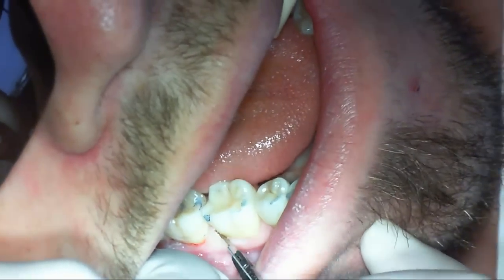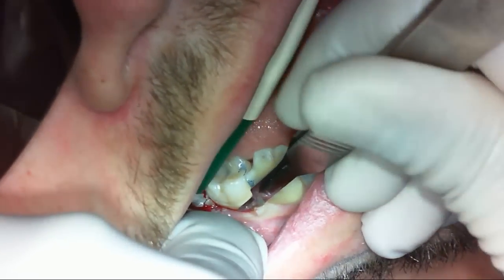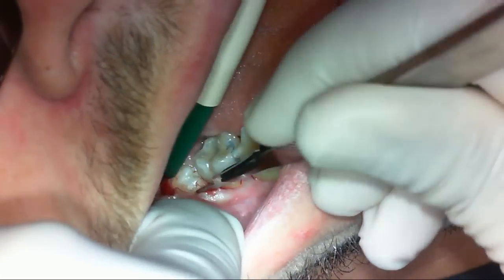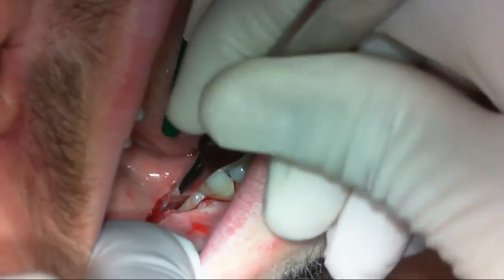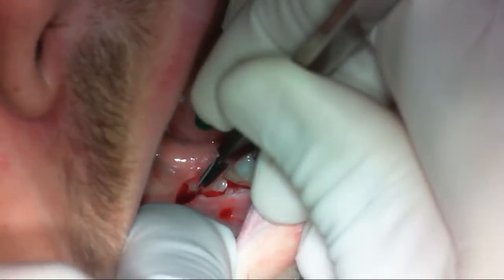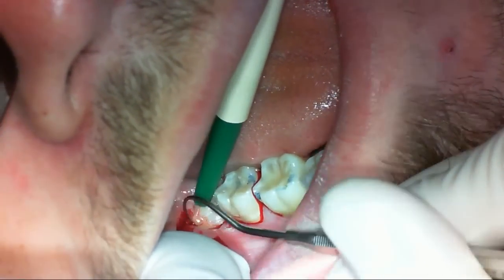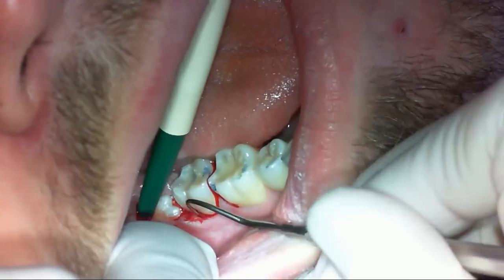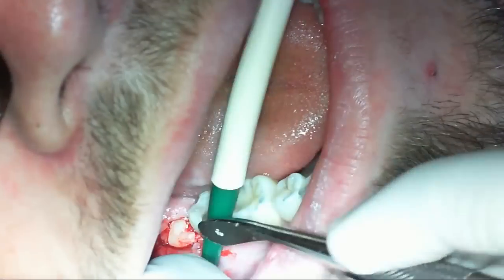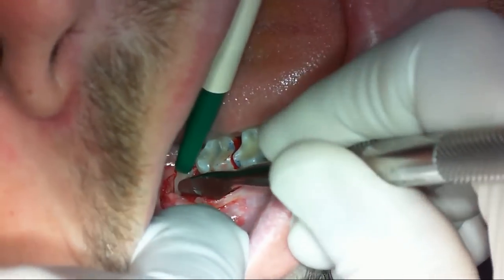I try to avoid any mesial relieving incision because I don't want to limit my access — just in case I need to make it bigger or the tooth looks much deeper than expected. By not doing a mesial incision, I have freedom to extend it as far as I want mesially. An important tip I learned from my mentor Dr. Anthony is to run your explorer to cut any remaining fibers between the gum and the bone, which makes reflection with your elevator much easier.